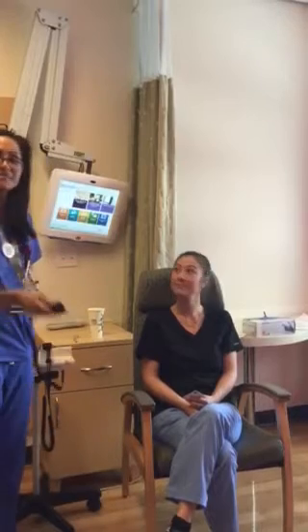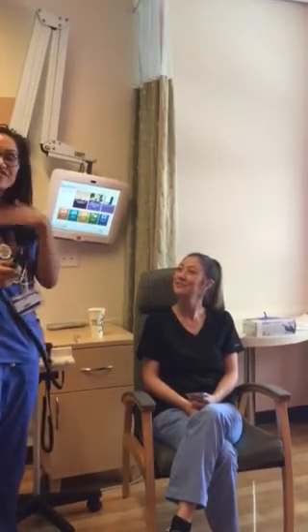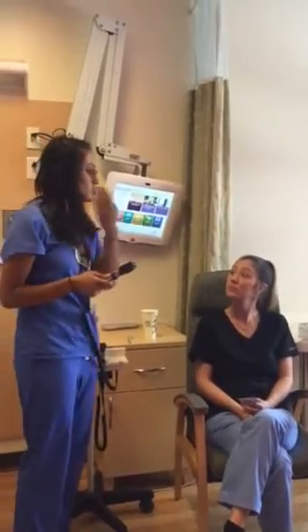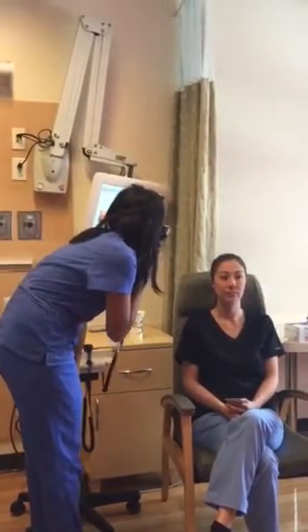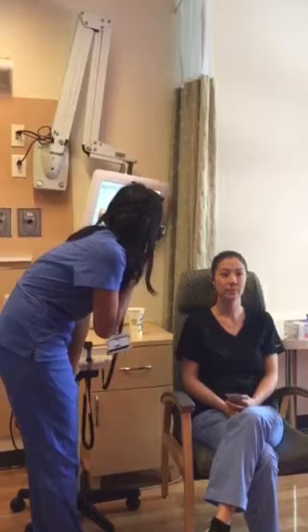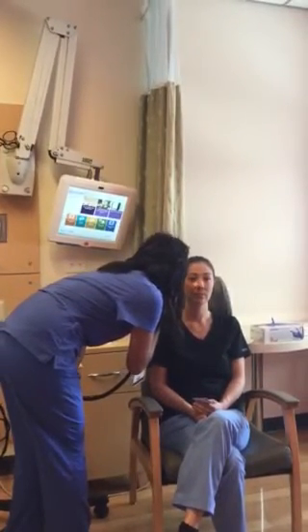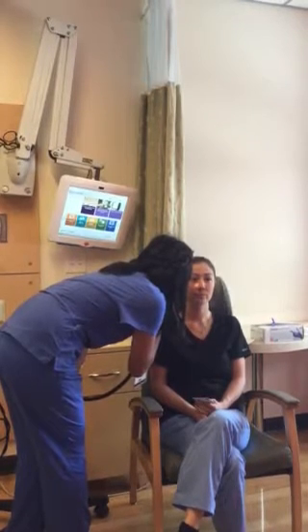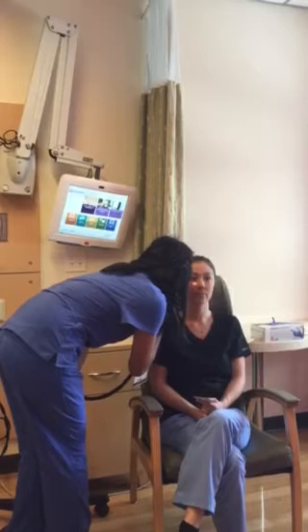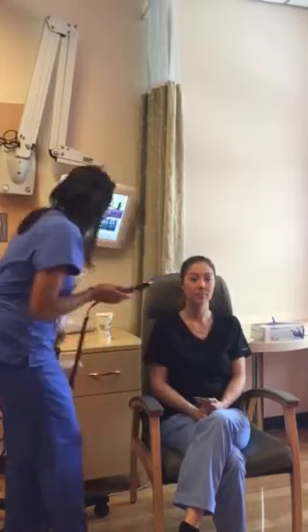Okay, so now I'm still going to use this guy, and this ophthalmoscope, and I'm going to look at Tiffany's eye. I'm going to look at her right eye, so I'm going to use my right eye, and you always want to make sure to do that for maximum patient comfort. So go ahead, look straight. Notice the red reflex, and follow the red reflex, that light all the way in. So when you are close to the patient's eye, you'll be able to notice the fundus, and you can look for any scars, and there's none of that. Okay?